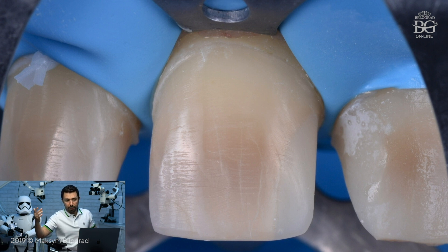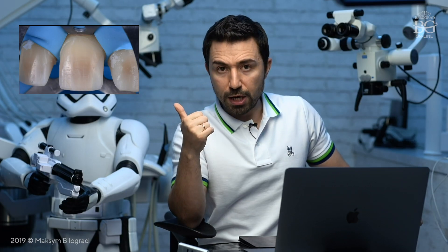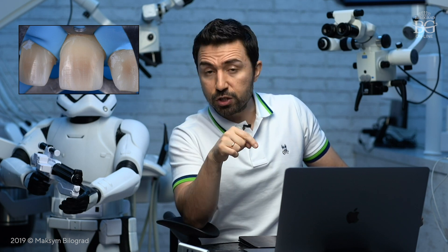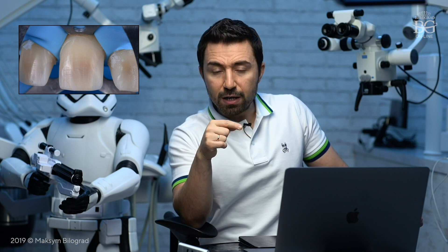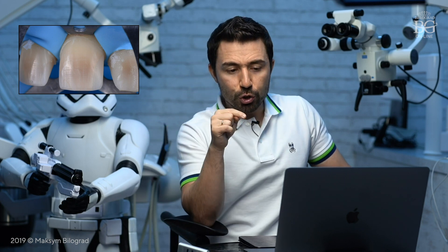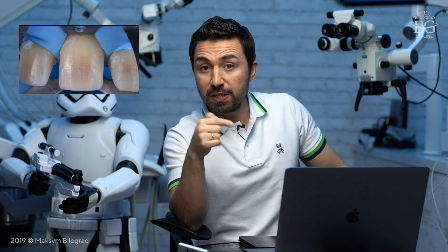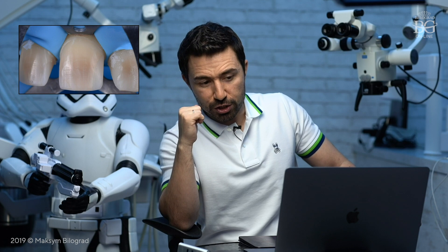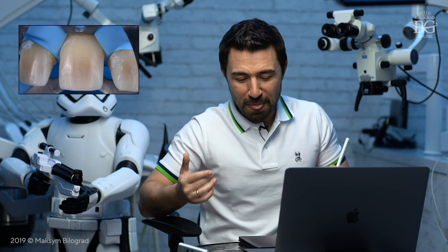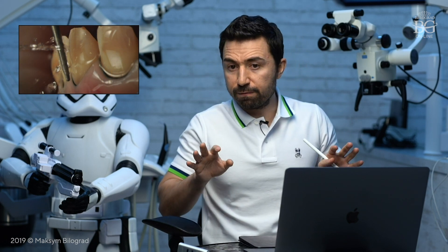Avoid going to the full depth of the sulcus: it makes impression-taking difficult, which can lead to poor restoration fit and compromise of the biological width. You can also compromise the biological width with overhangs of resin cement used to bond the ceramic restoration. So deep subgingival preparations create problems for yourself. After finishing, we removed the rubber dam and gave five to seven minutes of rest for the gingiva to recover from compression.